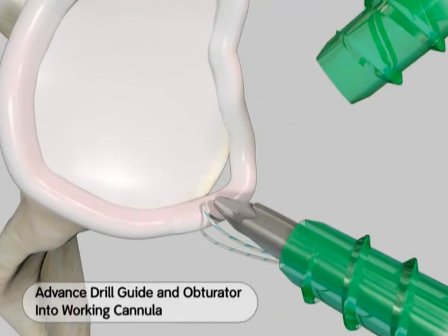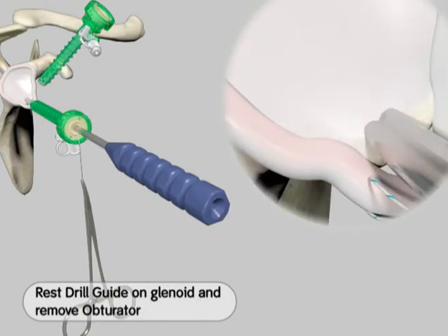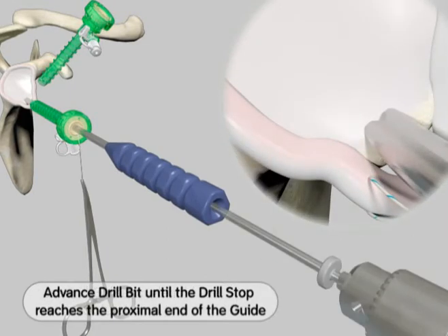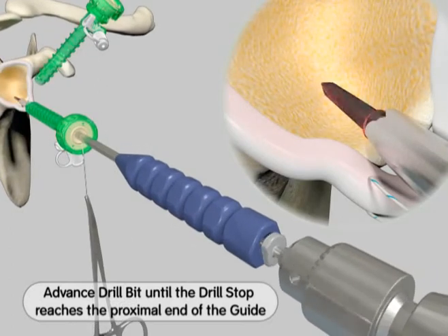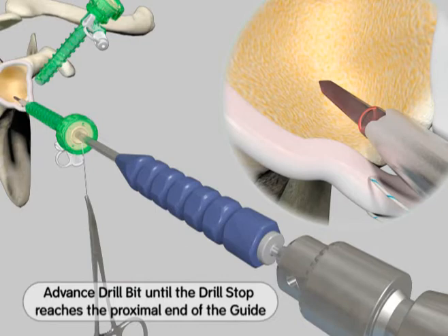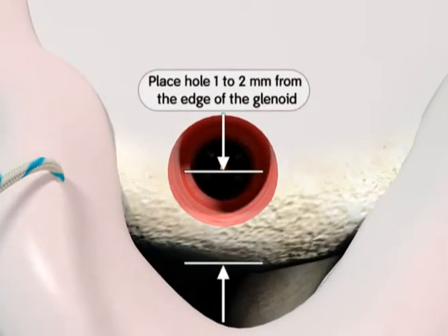Using the appropriate drill guide, place the distal tip of the guide against the glenoid. While firmly holding the guide in place, insert the proper drill bit and drill the hole. The depth stop on the drill bit will bottom out on the proximal end of the guide when proper hole depth is reached. Remove the drill bit and guide. Hole placement 1 to 2 millimeters from the edge of the glenoid allows for good visualization of the repair.